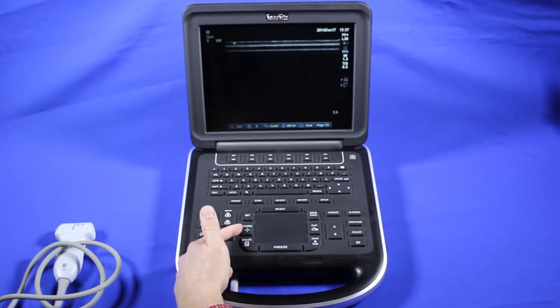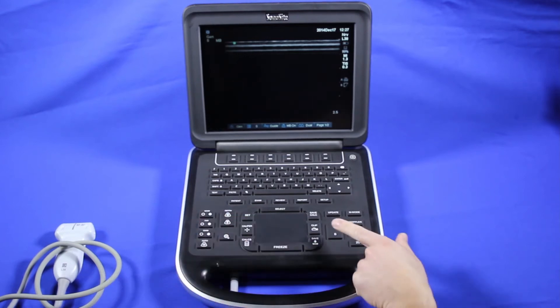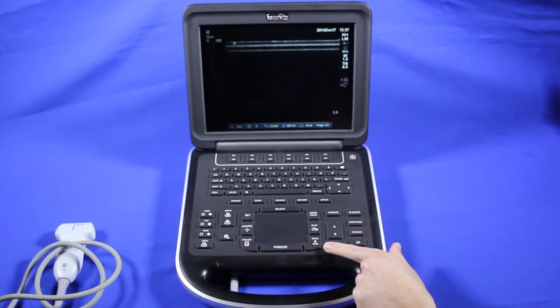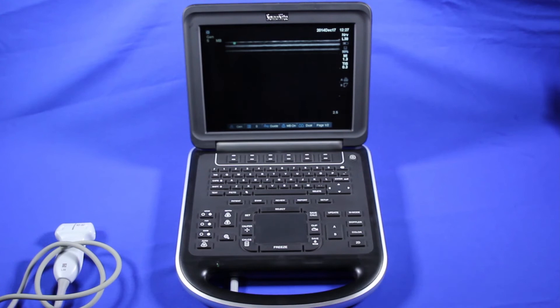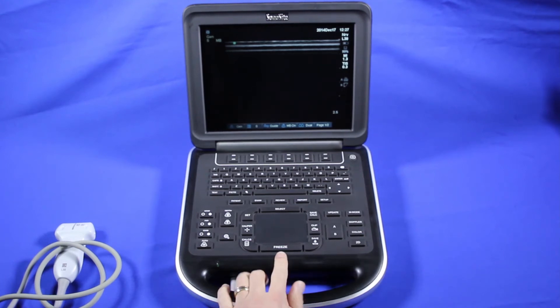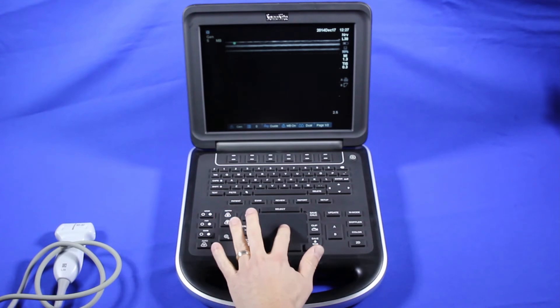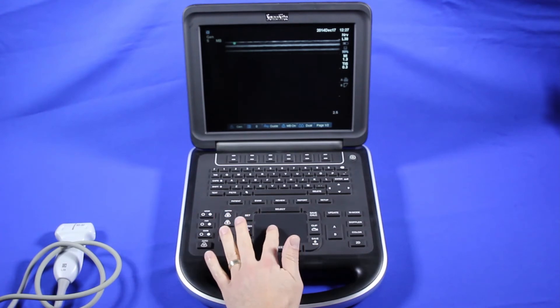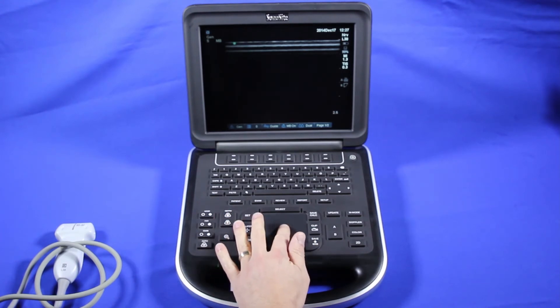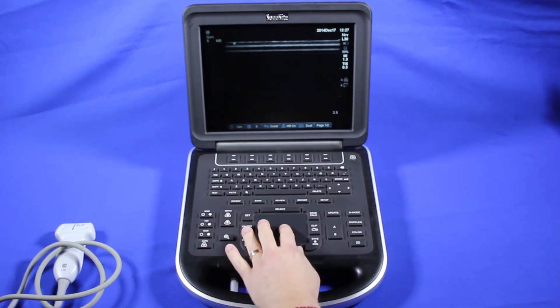You'll use a caliper to measure. Clip for saving clips, and save to save standard images — just one-frame images. Freeze will freeze the image. The trackpad is used to scroll through menus, select things on screen, or make your measurements.